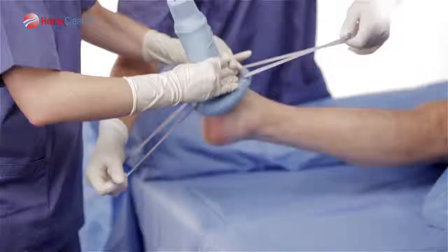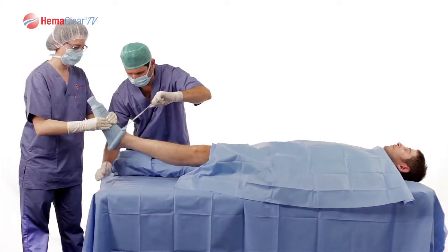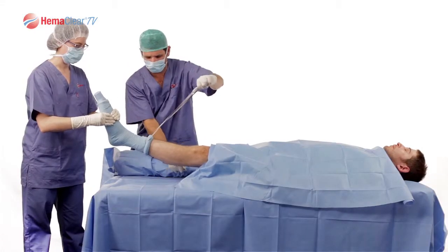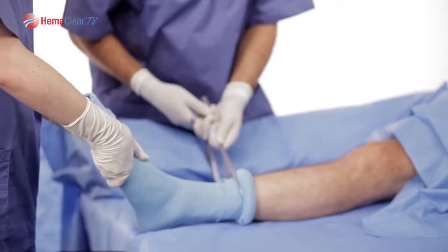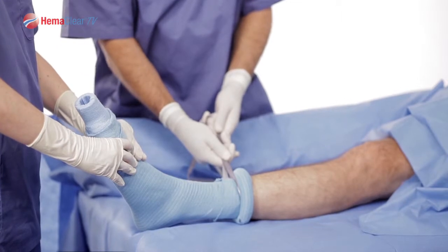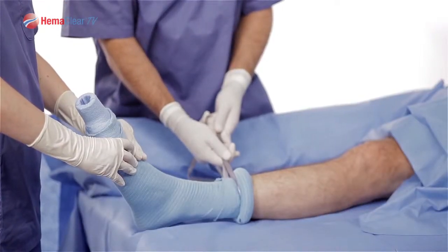Next, have one of your team members grab and raise the foot while applying axial traction. Grabbing the handles, advance Model A over the heel using the bottom handle as leverage. While pulling Model A approximately towards the chest of the patient, advance the ring to just below the calf muscle, approximately 15 cm or 6 inches proximal to the lateral malleolus. The tourniquet is now up.